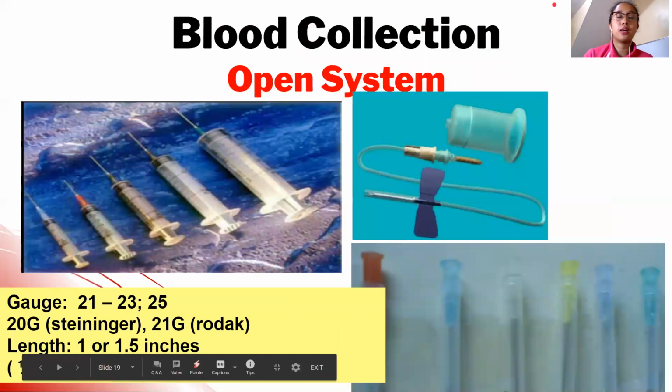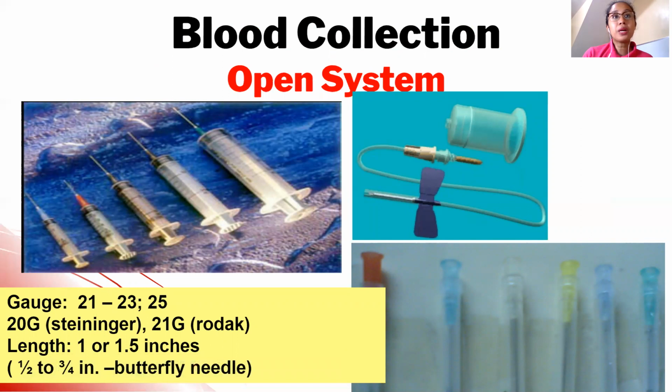Tapos yung mga antiseptic solution. So the needles that we use, we measure the size of the bore of needles. Kung gaano kalaki yung diameter ng bore, we call it gauge. So the higher the gauge, the smaller the bore. Pag ako usually, sa liit ng veins ko, talagang 25 gauge yung sa akin kasi ang liliit ng veins ko, class. Normally what we use is 20G and 21G. Ang sakit na din sa akin at usually hindi natatamaan.